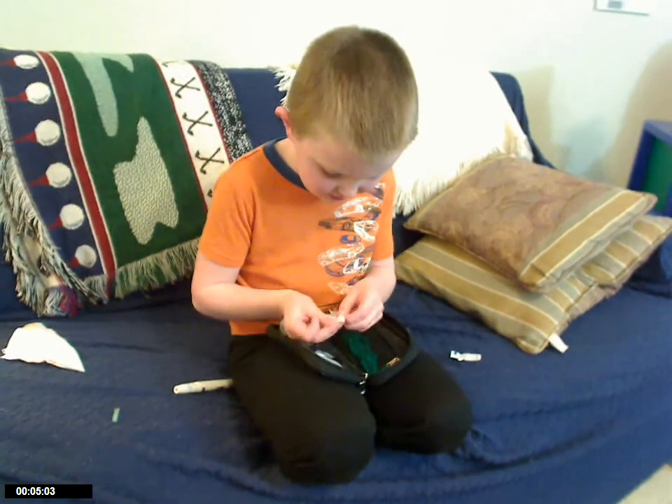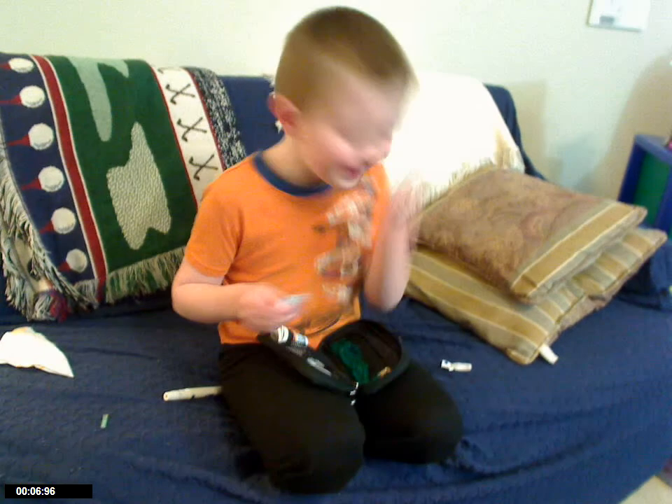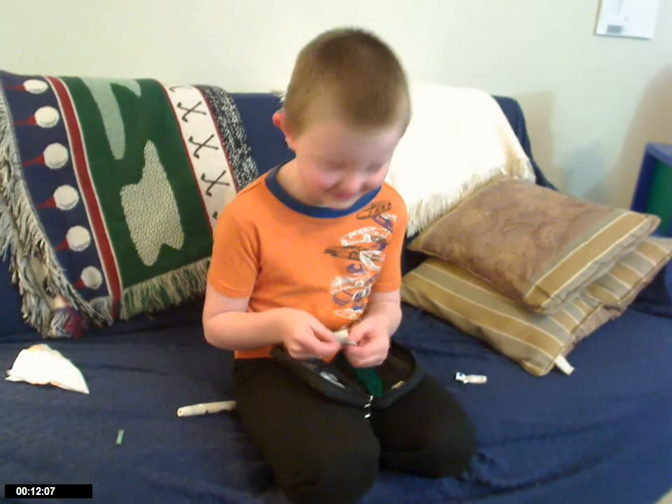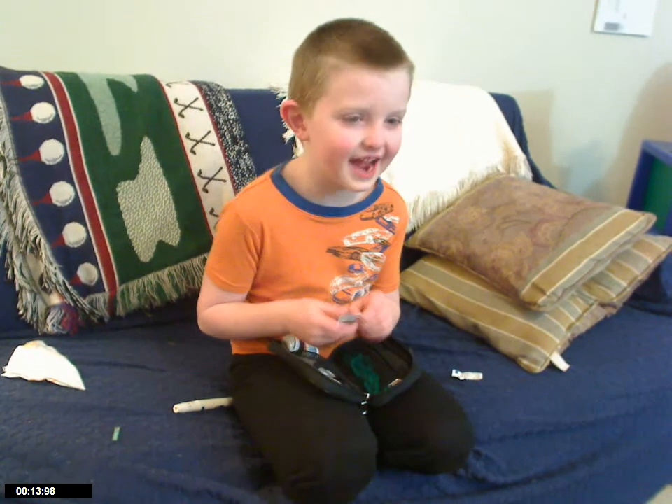What is your name? Caleb. And what are you doing? Checking my blood sugar. Why do you have to check your blood sugar? Because I have diabetes.